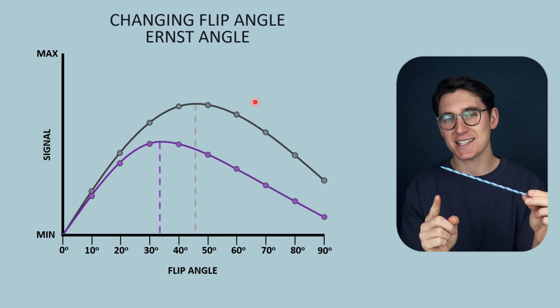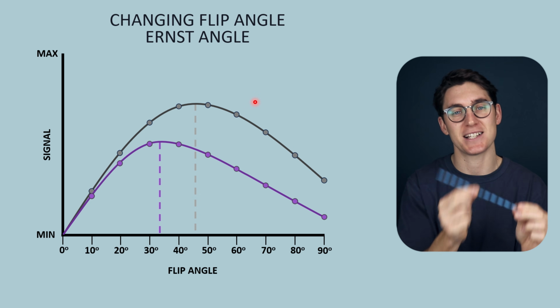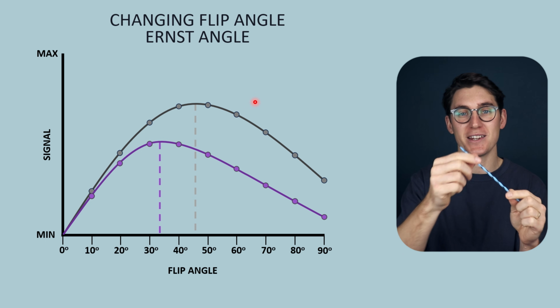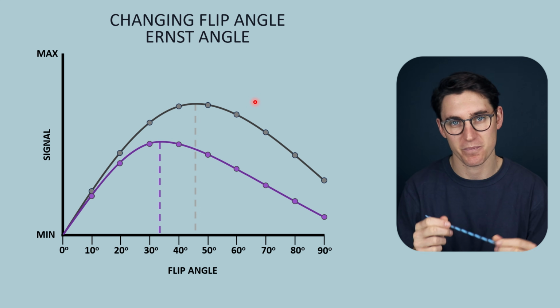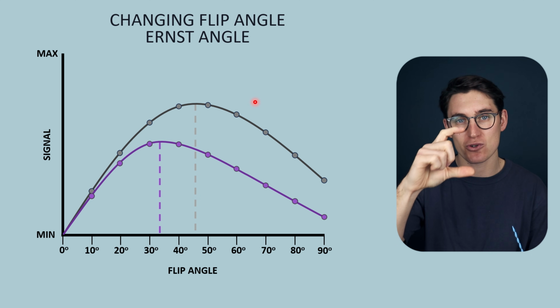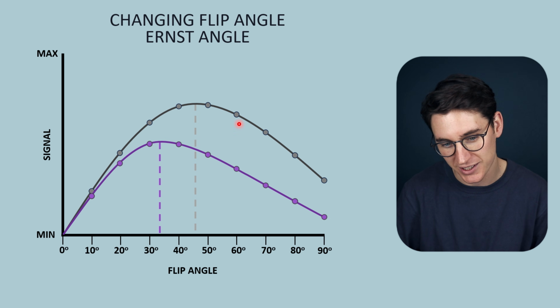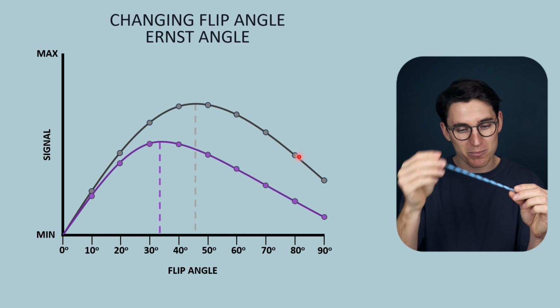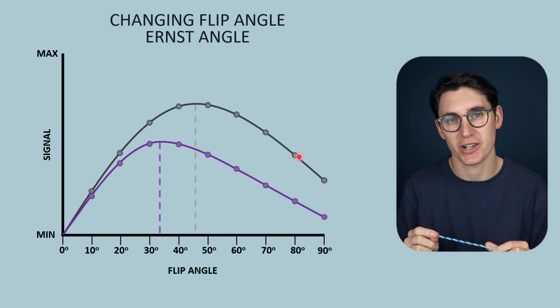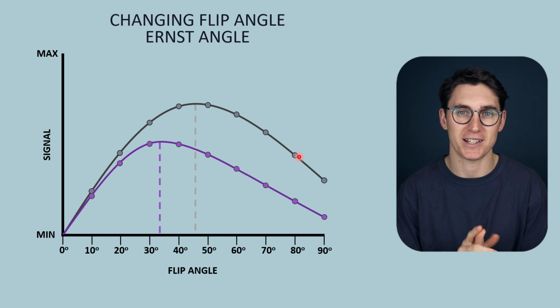And we know that at the TR, at the RF pulse that we apply to flip that spin again, or that net magnetization vector again, it's the degree of longitudinal recovery that's going to determine the magnitude of that transverse magnetization. And if we're not fully recovering that longitudinal magnetization, we're going to get a drop-off in the degree of transverse magnetization. And that's why at higher flip angles, we were getting a drop-off of signal here. That net magnetization vector within that specific tissue is said to have partial saturation. There's been loss of signal because it hasn't been allowed to fully recover its longitudinal magnetization.